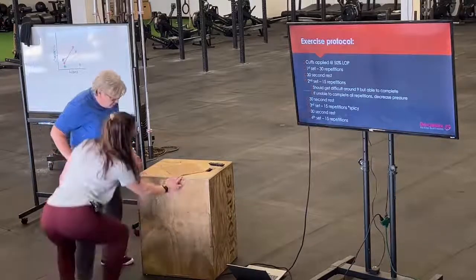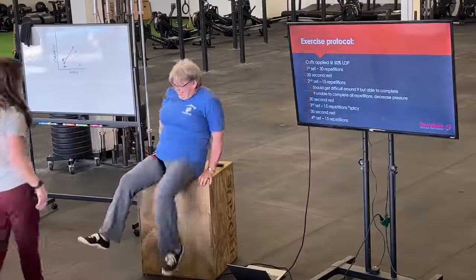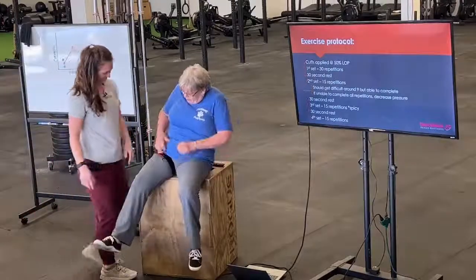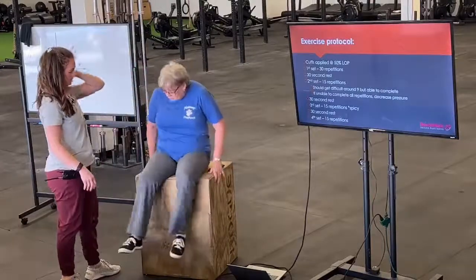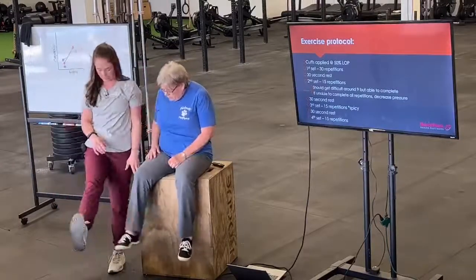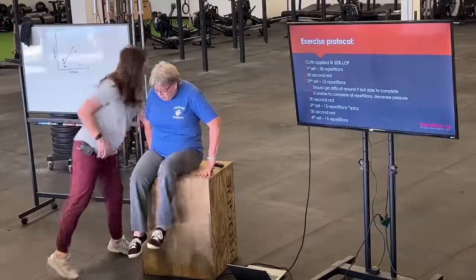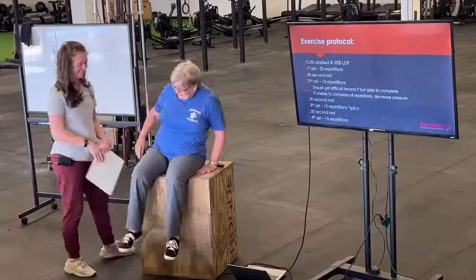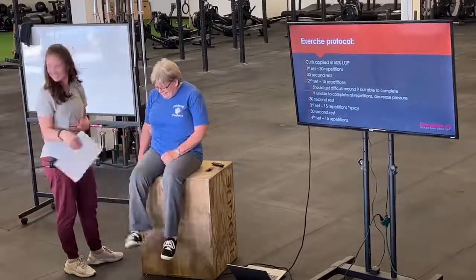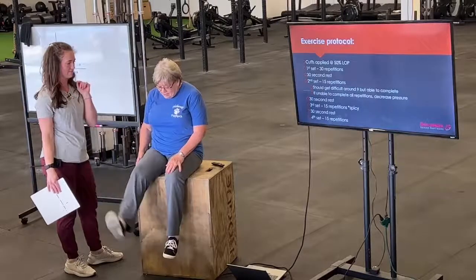Okay, go ahead and sit up here then. And bend your knee. And so then I would have you just go through the same protocol. So we're going to go up and down 30 times, all the way through full range of motion. Okay, yes, 30 times, okay?